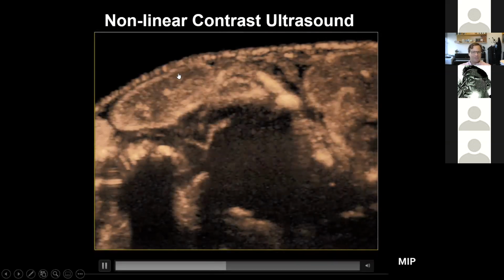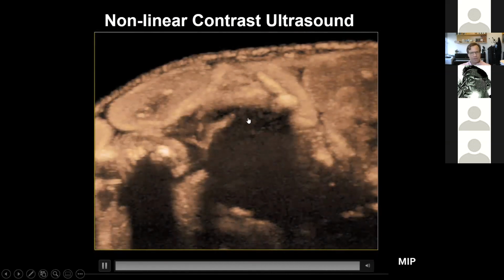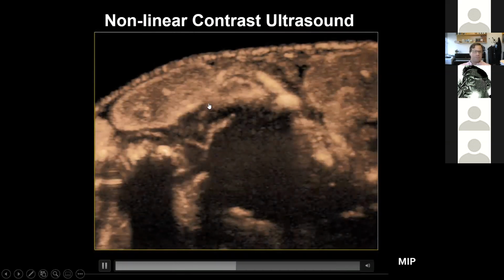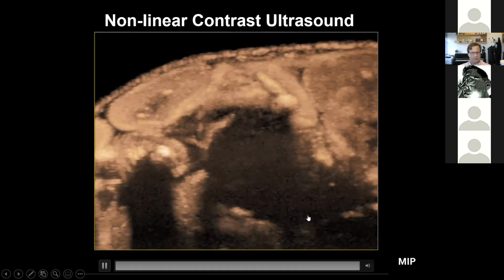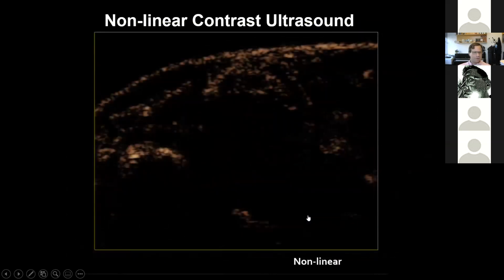And so as that contrast agent comes into the tissue, you can see really great vasculature in the intestines all around that tumor, but the pancreatic tumor is actually very poorly vascularized, and this is an established feature of the biology of pancreatic ductal adenocarcinoma. This type of image was utilized in discovering this concept and establishing it both in mice and later in humans as well. In fact, to be fair, radiologists have been diagnosing pancreatic cancer as a poorly enhancing lesion in the pancreas for the past century or so.